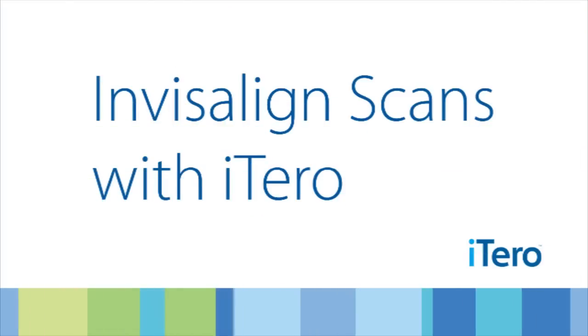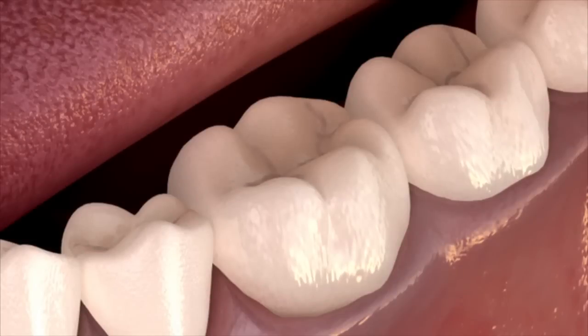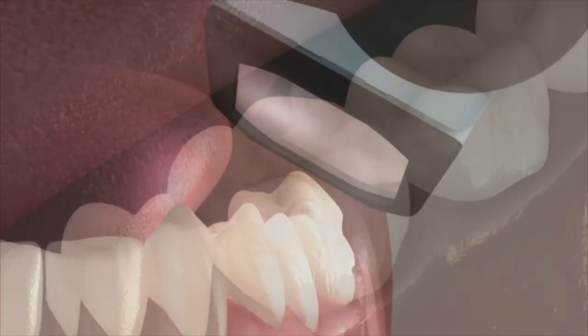Taking Invisalign scans with the iTero and IOC Digital Impression System. Because the interproximal regions are so important in orthodontics, use the following technique when performing scans for Invisalign.